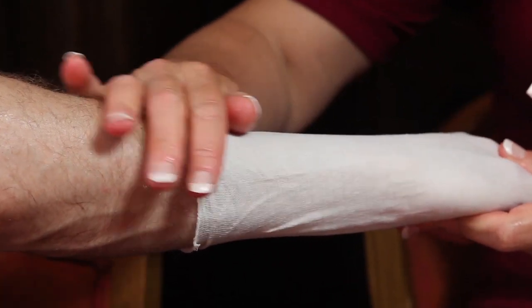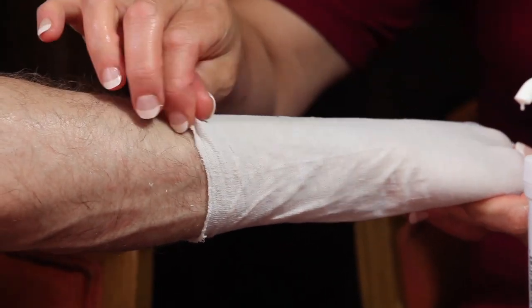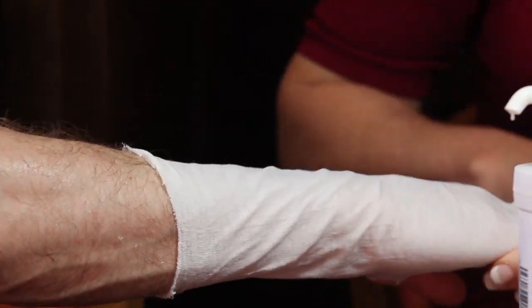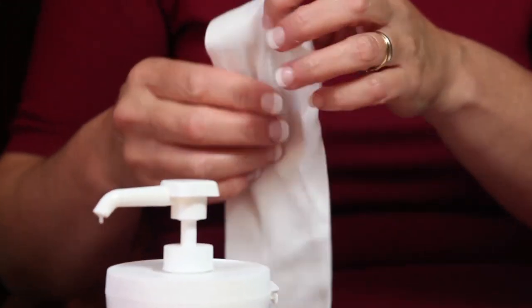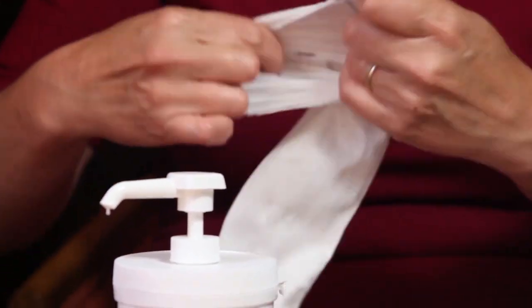Smooth it down a bit so you don't get any wrinkles. I tend to keep the blue line nice and neatly in the middle there, and then we just simply get another layer here.